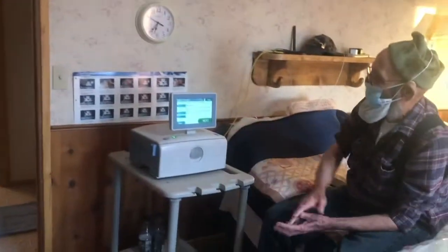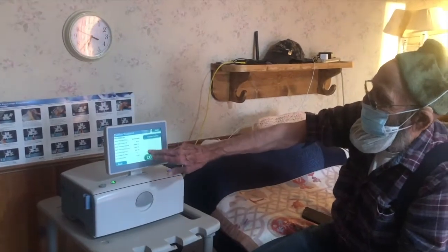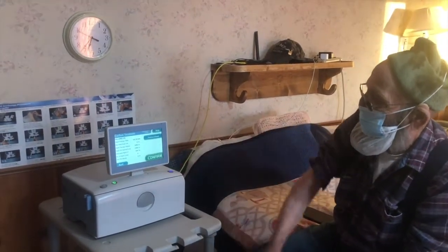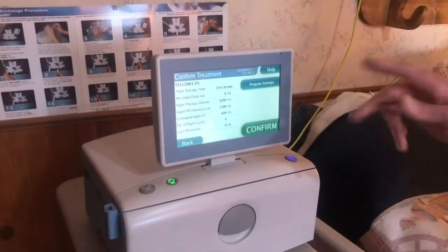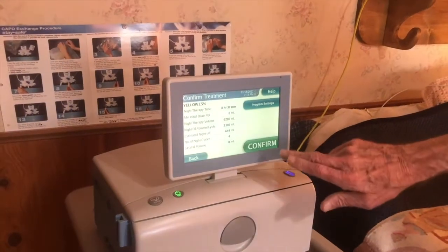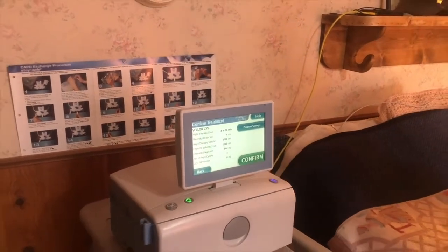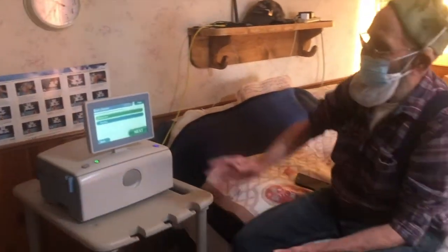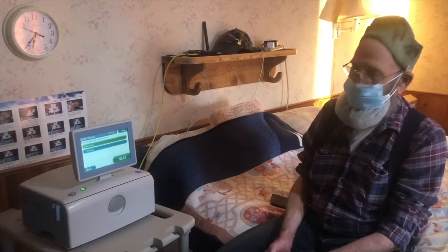So then we go to the next screen. Review your program settings, and if necessary, touch modify. When finished, touch confirm. These are the settings they expect this machine to do during the night. So I accept that as the way it's supposed to be. So now we're going to select a drain option, an open drain tonight. Touch next.